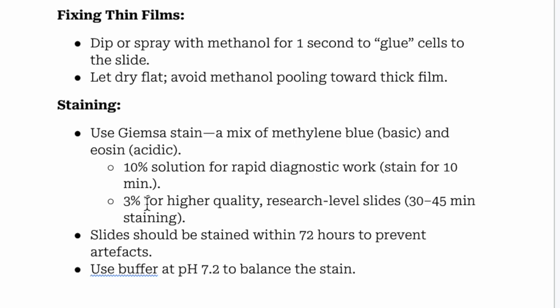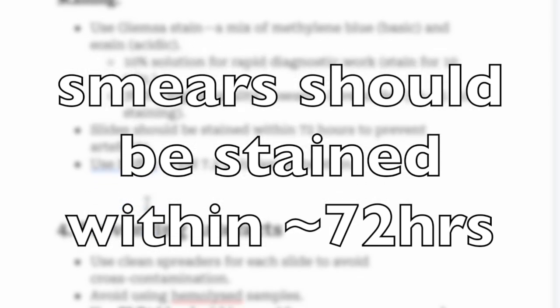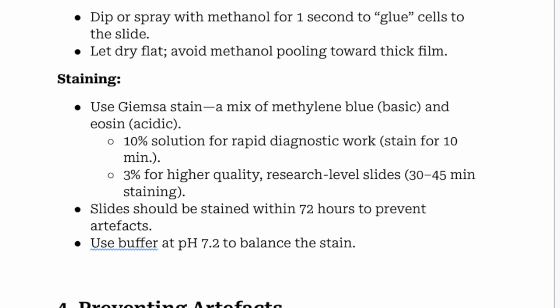Once you've made your slides, you don't have to stain them straight away. As long as you do it within 72 hours, you will get appropriate details to speciate your parasite or count your parasite if it's a thick smear.